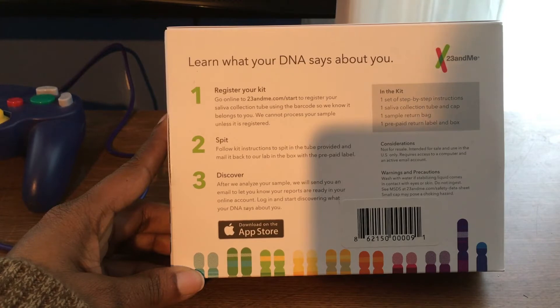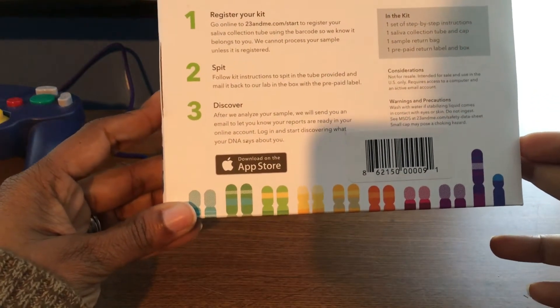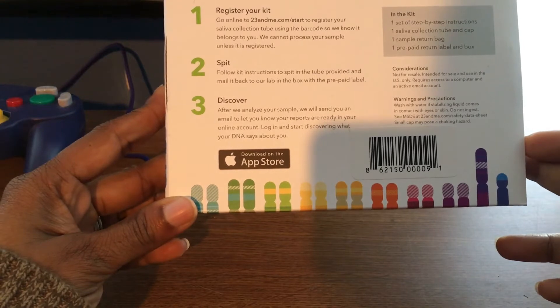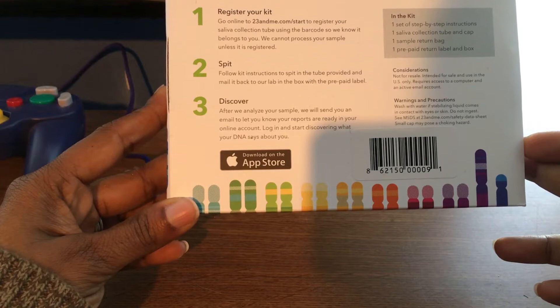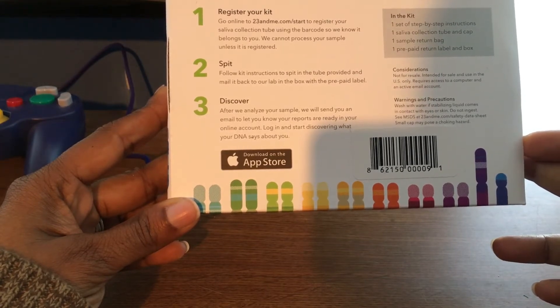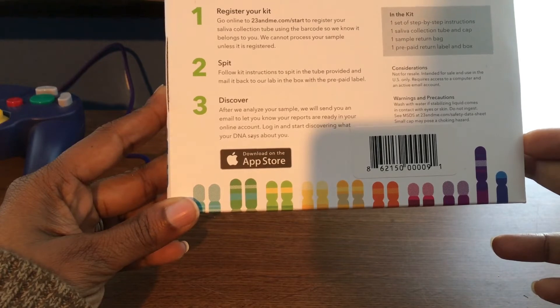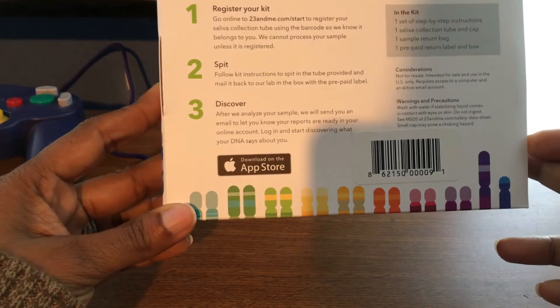Step two says to spit — follow the kit instructions to spit in the tube provided and mail it back to the lab in the box with the prepaid label. Step three says discover: after they analyze your sample, they'll send you an email when your reports are ready. Log in and start discovering what your DNA says about you.